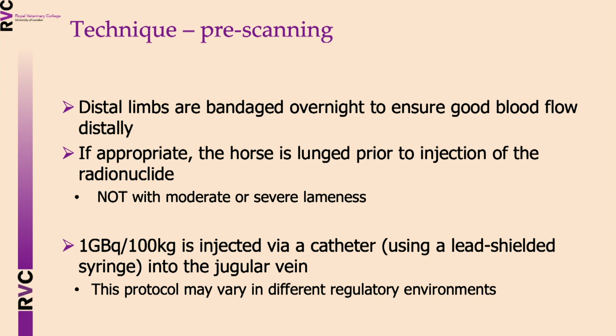To ensure good perfusion of the bloodstream to the distal limbs, we bandage the distal limbs overnight before injection to ensure good blood flow to the limb.